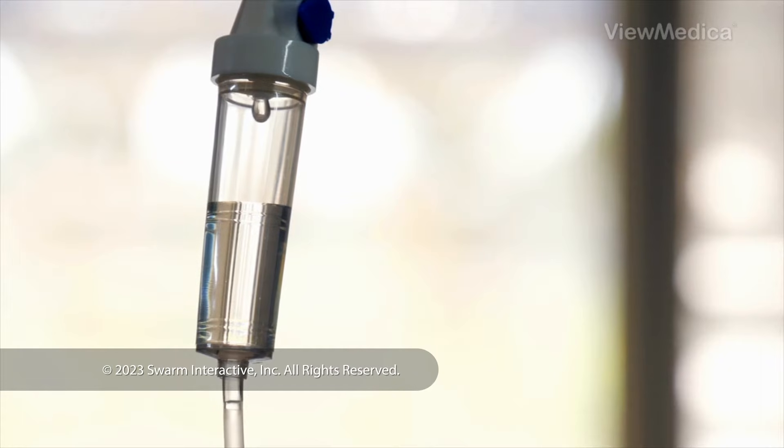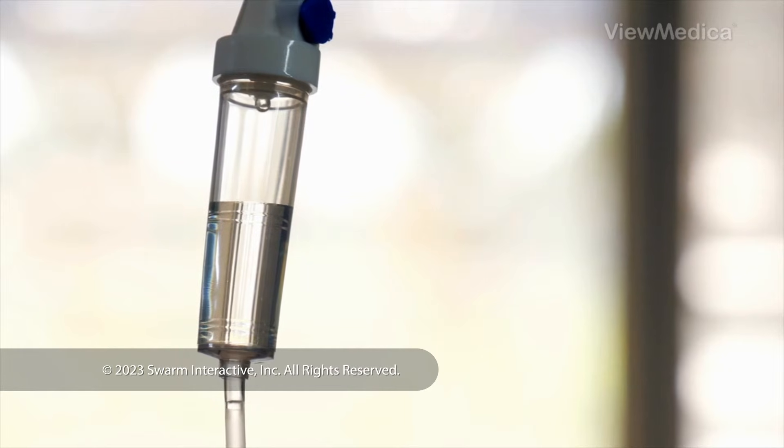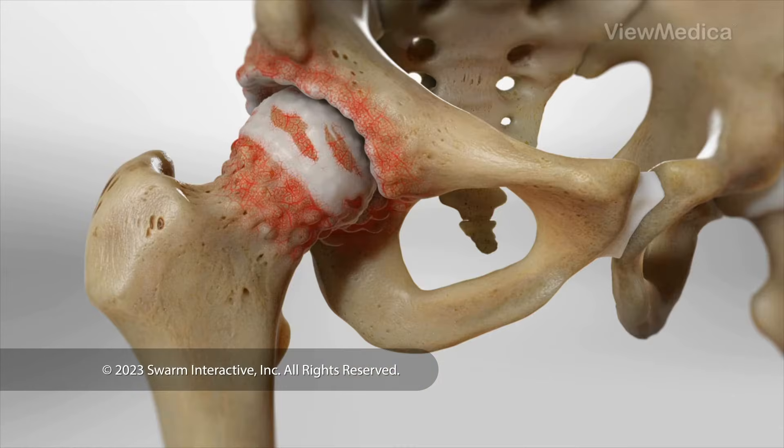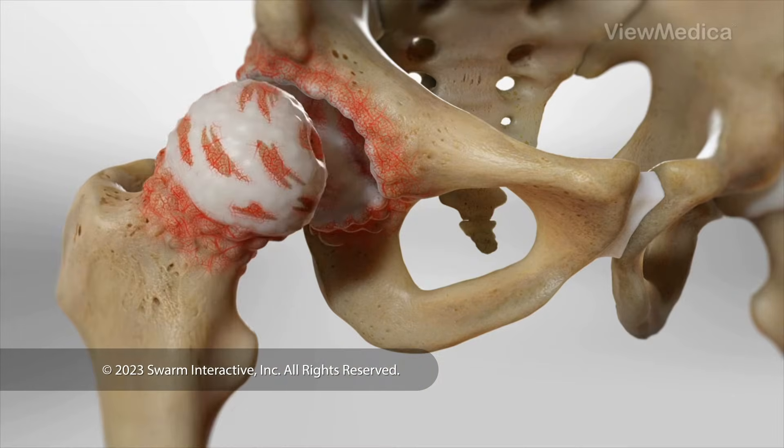To begin, we give you medicine to put you to sleep. We make an incision to reach your hip joint. Then we remove the damaged head of your femur.